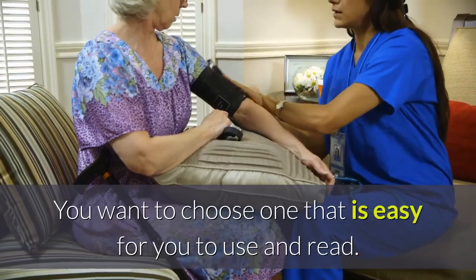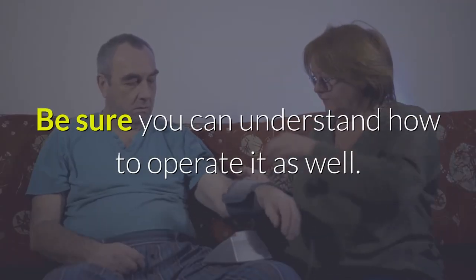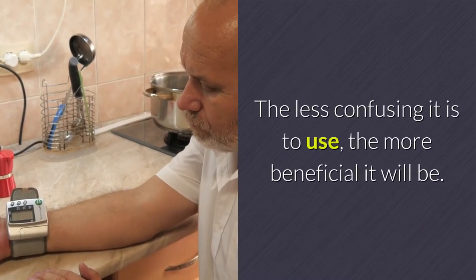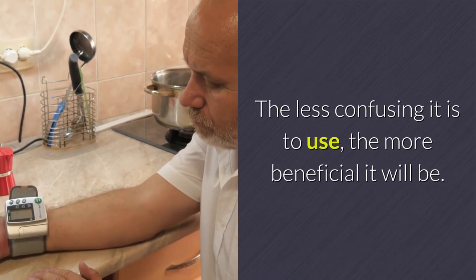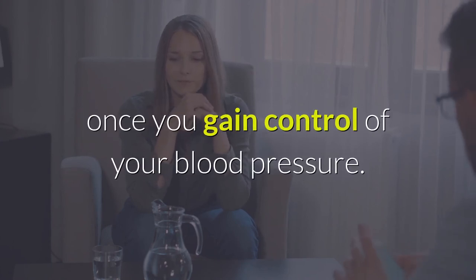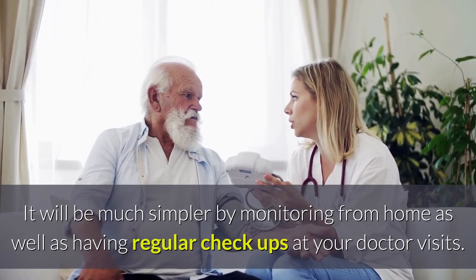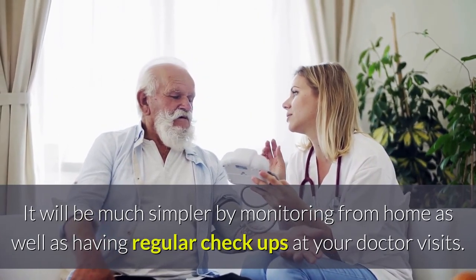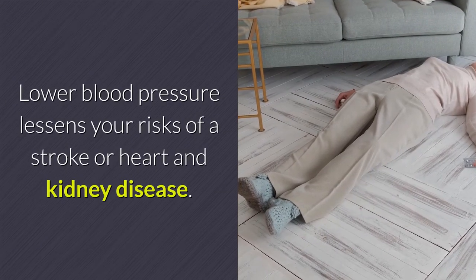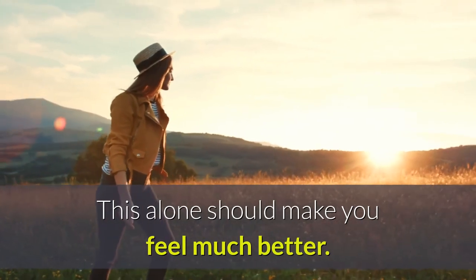You want to choose one that is easy for you to use and read. Be sure you can understand how to operate it as well. The less confusing it is to use, the more beneficial it will be. Imagine how much better you are going to feel once you gain control of your blood pressure. It will be much simpler by monitoring from home as well as having regular checkups at your doctor visits. Lower blood pressure lessens your risks of a stroke or heart and kidney disease — this alone should make you feel much better.